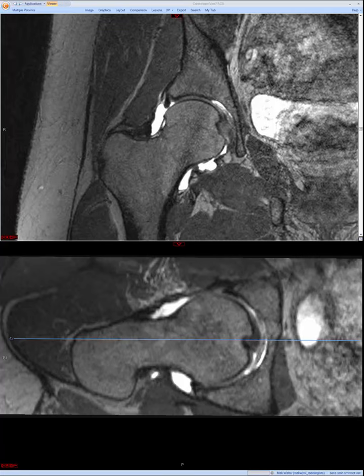However, if it's a more vague hip pain type story, or assess lesion, look for mets, or assess for avascular necrosis, or assess for trochanteric bursitis, we may benefit from expanded coverage and an increased field of view to ensure that we allow for adequate assessment of all the periarticular structures. But of course this would then compromise evaluation of the acetabular labrum and cartilage.